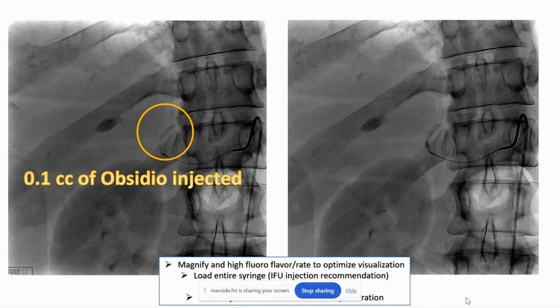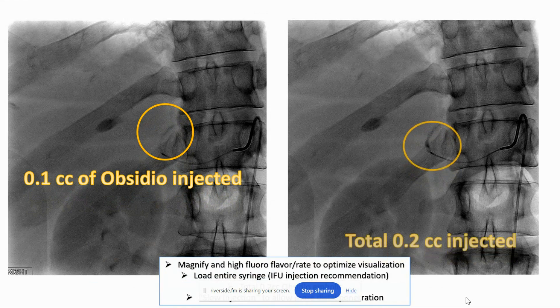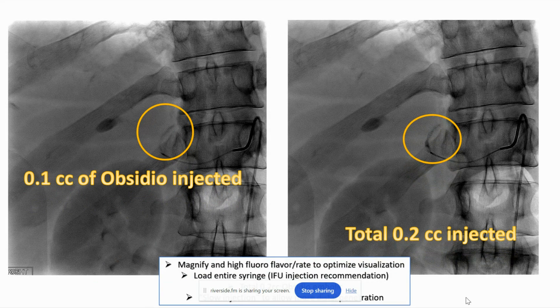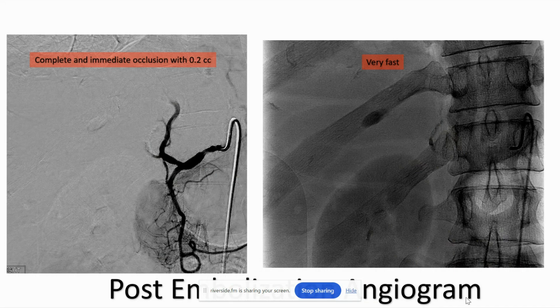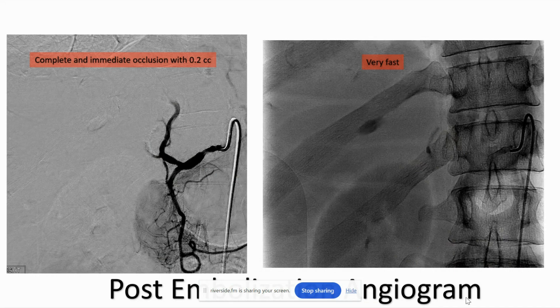To review this over still images: this is after 0.1 cc's — so tiny, tiny amounts. You can see that you can sort of faintly visualize the Obsidio there, but then after just another 0.1 cc, it becomes readily more apparent and more obvious.